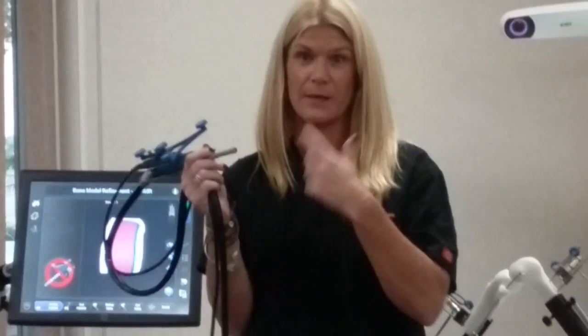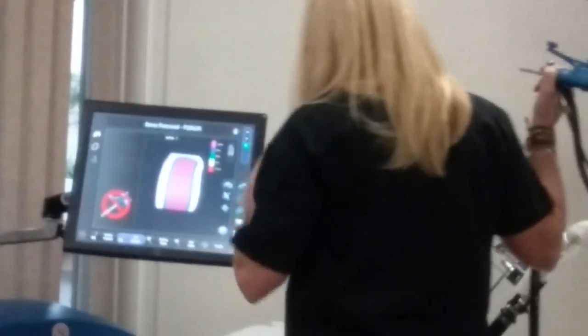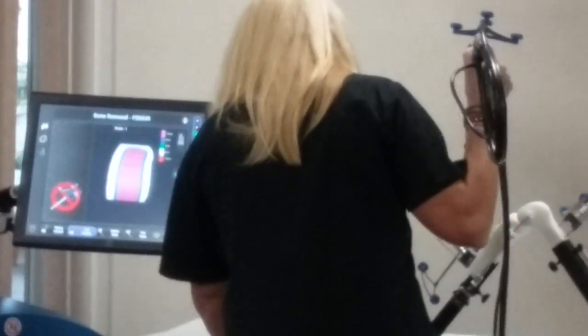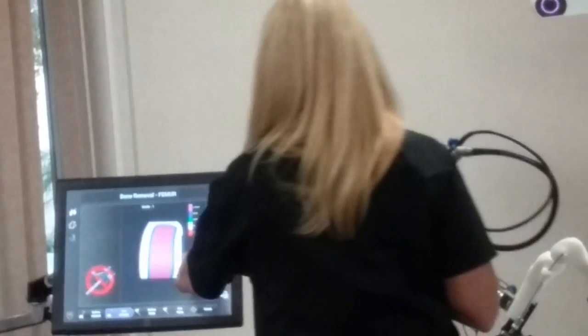It's like going to the nail salon and getting your nails done. It's like a high-speed nail file. Okay, so it goes at 80,000 RPMs. It's really fast. These colors represent a depth of resection. So this is the really cool part: this will only let the surgeon cut what we've designated to cut for that procedure and that patient's anatomy.